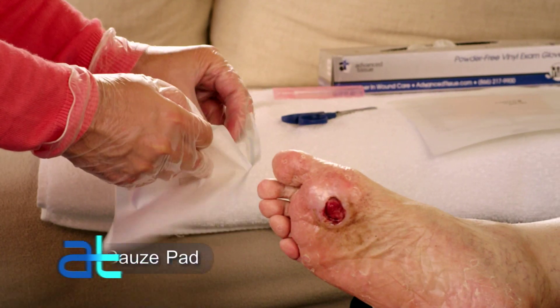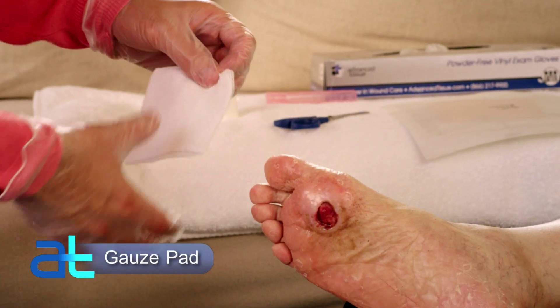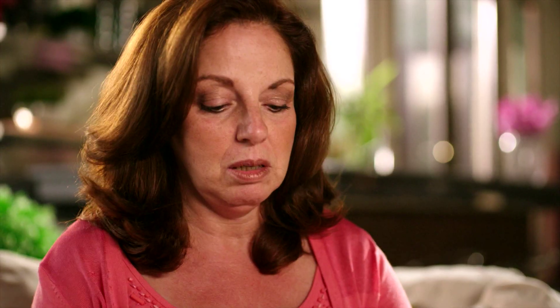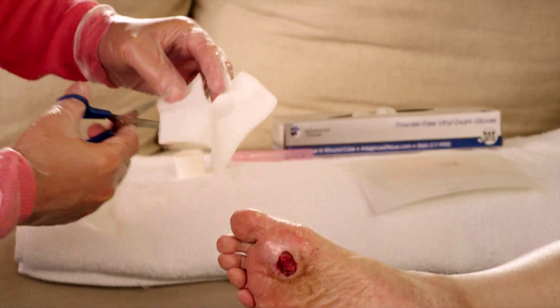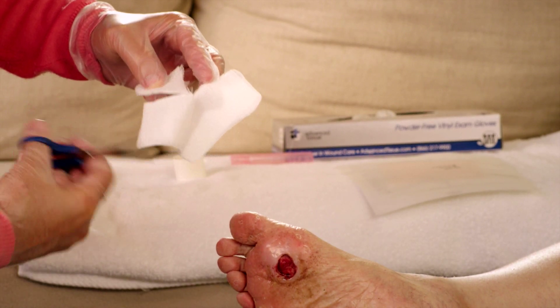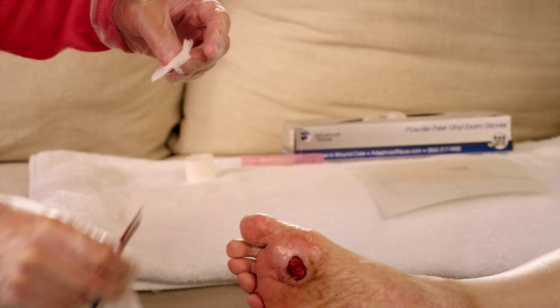They gave us everything we need. The gauze dressing will be applied directly to your wound bed. Moisten the gauze with saline before applying. Just cut it to size. When trimming your dressing, you should only use clean scissors that are designated for wound care purposes.